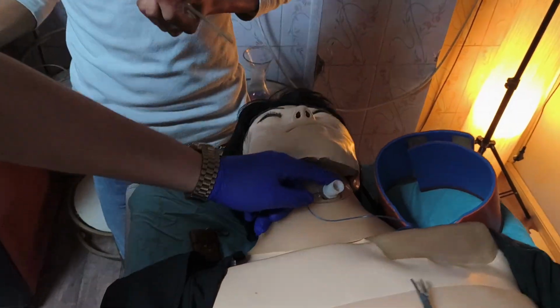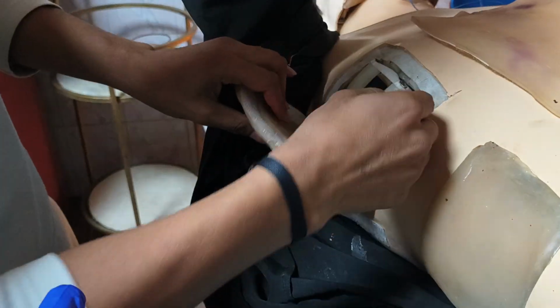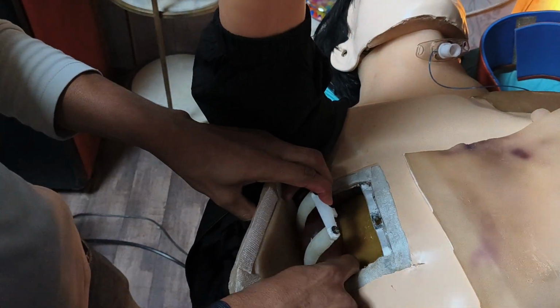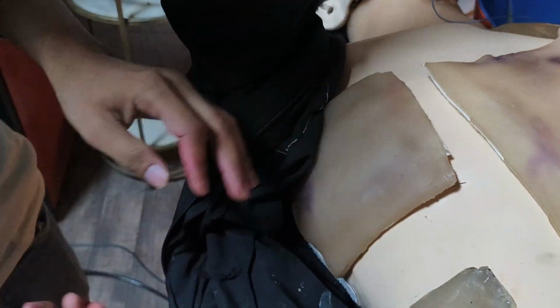So you can do surgical cricothyroidotomy. Okay. Now next is needle decompression. Like this, first you can play pneumothorax and then you can place this bladder and you can play hemothorax scenario also. I will demonstrate. So we are now going to do needle decompression and ICD insertion.